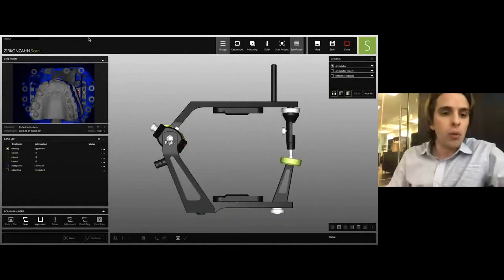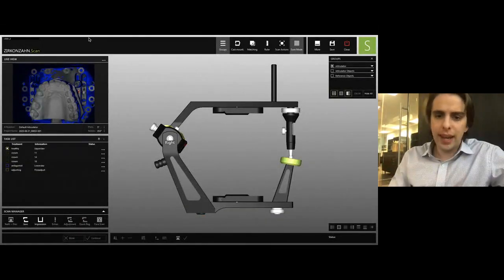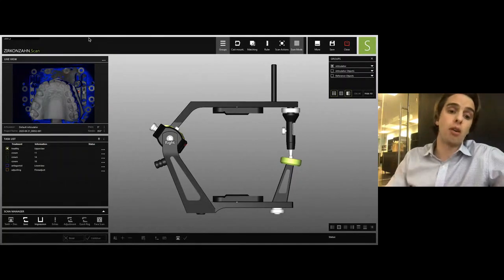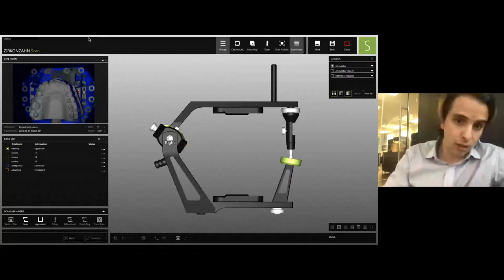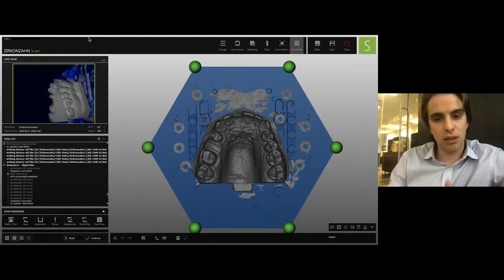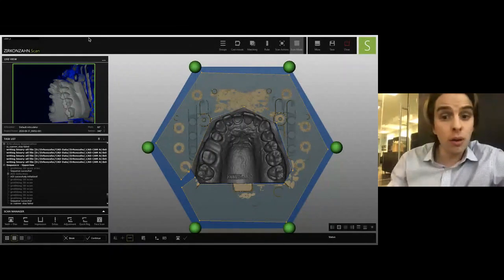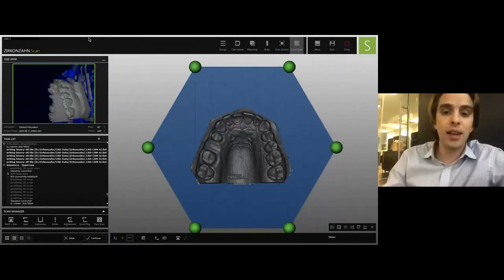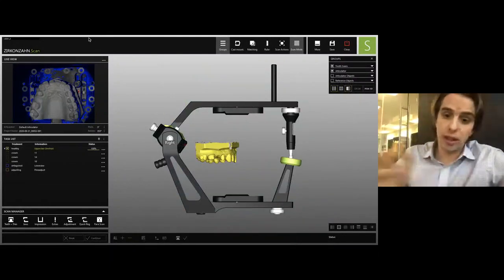And here we have a virtual articulator and the opportunity to scan in dental models or import digital models. And so in this demonstration, we'll actually use the desktop scanner, and we take a 3D image within 5 microns of accuracy of the working model. We can trim the model much like we would in our gypsum room, and then it just falls arbitrarily into the virtual articulator.